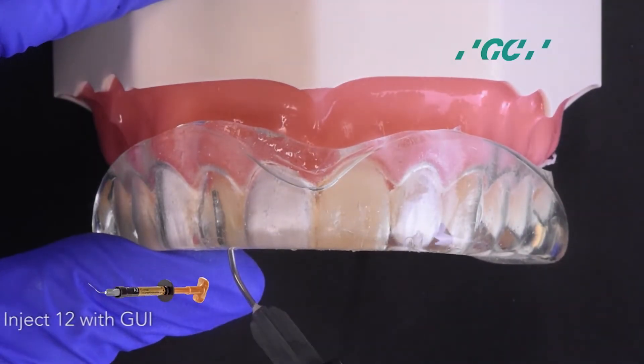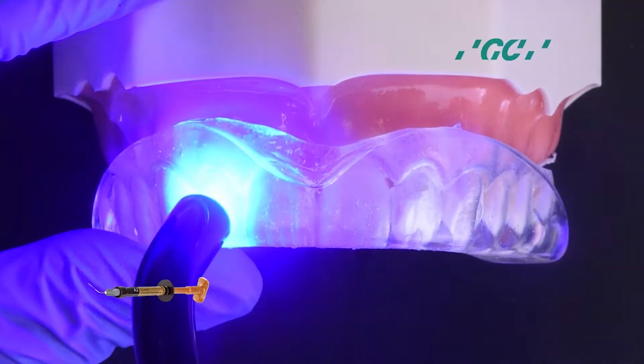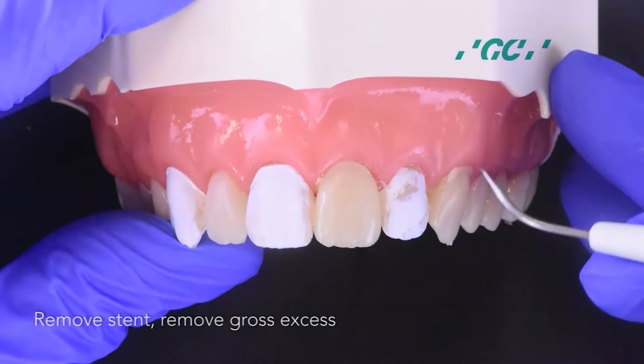Inject 1-2 with G-Aneal Injectable, then light cure. Take out the stent and remove the gross excess.